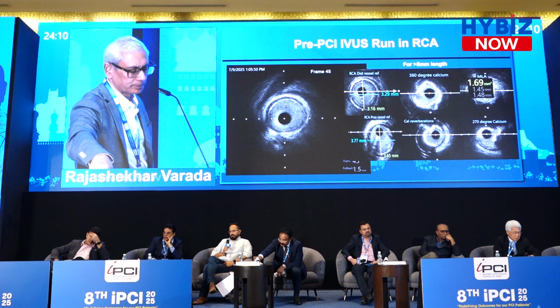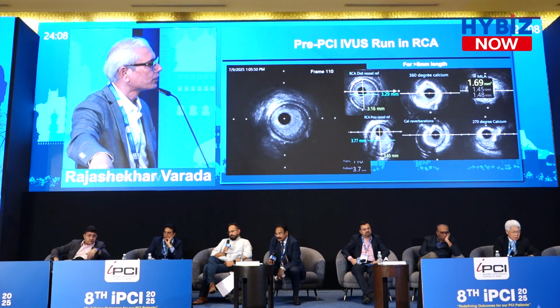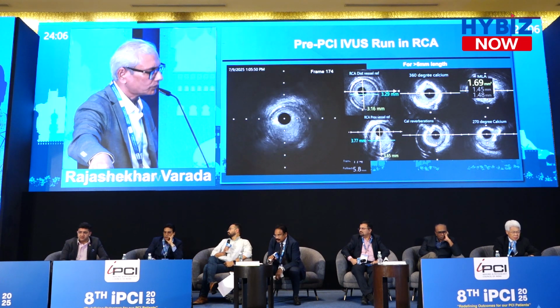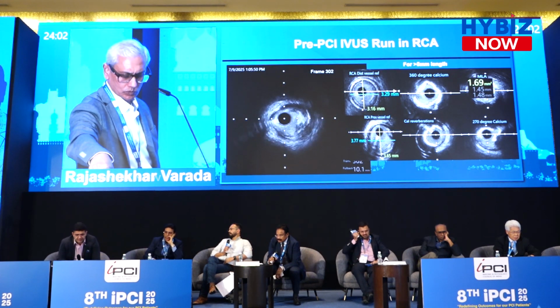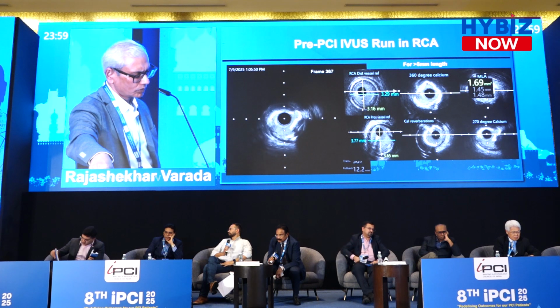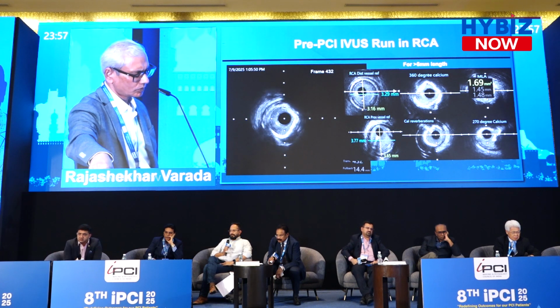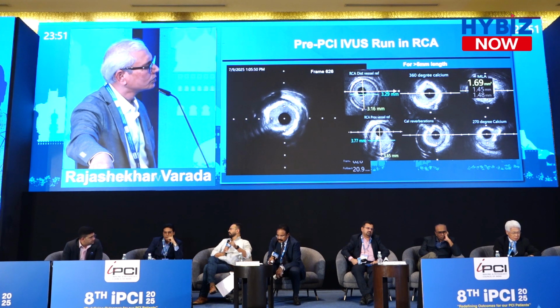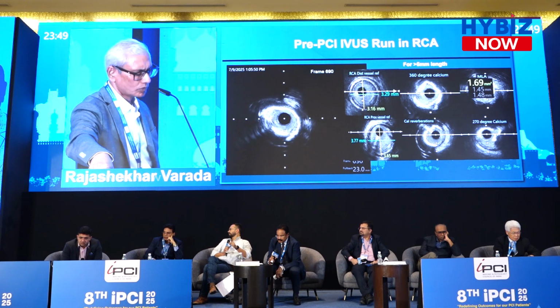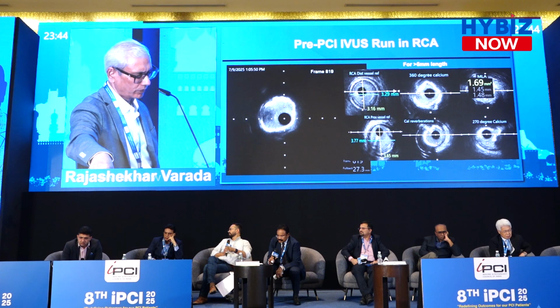Yeah. After looking at the IVUS, the vessel is wide, roomy actually. There is no critical stenosis or nodular protrusion where taking the hardware should be a difficult task for the operator. And the wire bias is not very favorable. It's in the center. So I have to go with an IVL, appropriate sizing of an IVL in this case. Do an IVL followed by an NC balloon or a cutting balloon and put a stent.